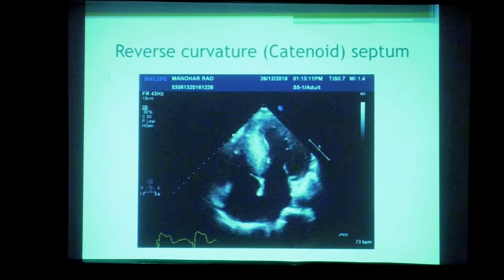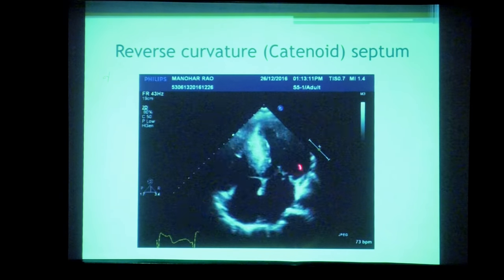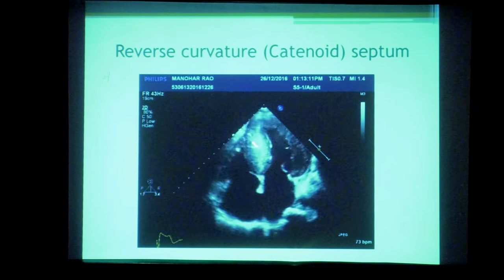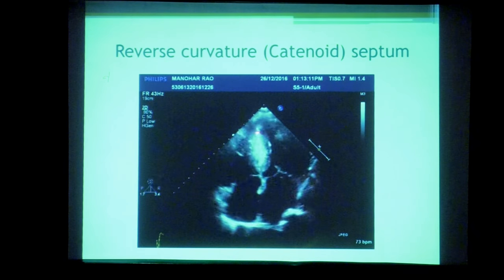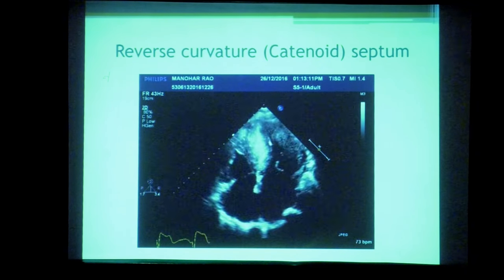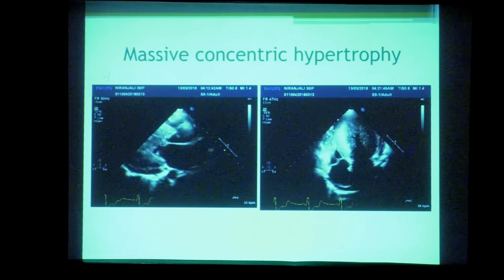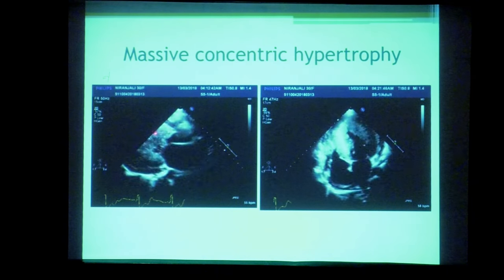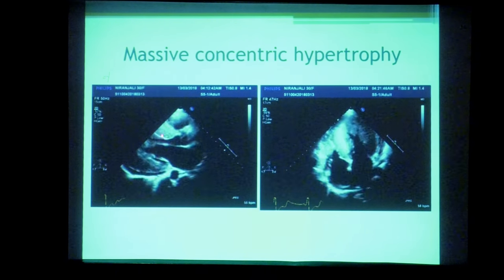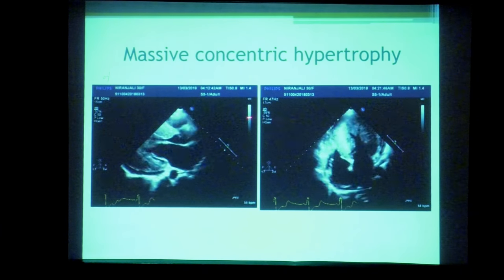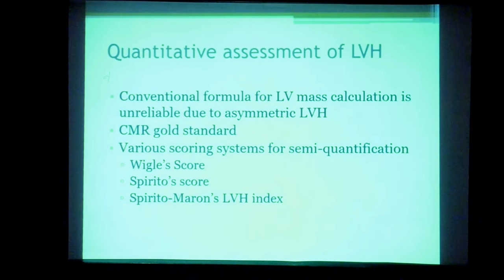This example shows catenoid septum hypertrophy where the septum bulges into the LV cavity with maximum thickness in the mid portion of the IVS. There is diffuse hypertrophy with a predominantly hypertrophied septum, and a sparkling or granular texture of the septum is visible. Another patient demonstrates massive hypertrophy of both the septum and posterior wall — the septum is grossly hypertrophied, the posterior wall is significantly hypertrophied, and even the right ventricle is hypertrophied, including the apex and lateral wall — the whole myocardium is massively hypertrophied.